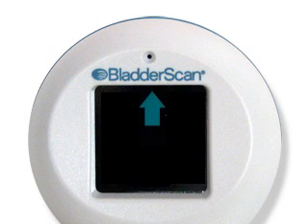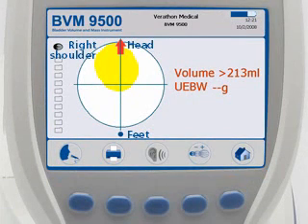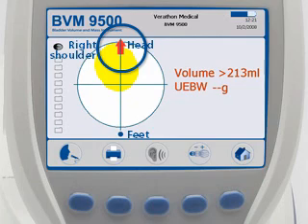If the arrow on the probe screen is flashing, you are significantly off target and must re-aim and re-scan. The console screen will show a red arrow indicating the direction to re-aim.